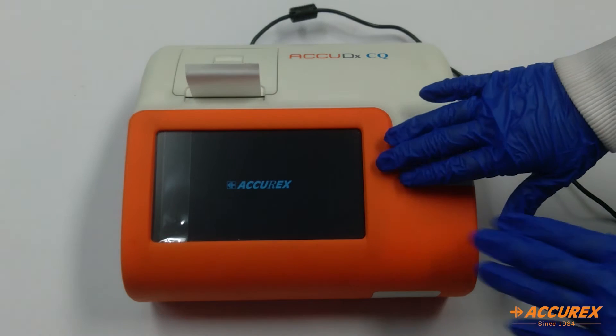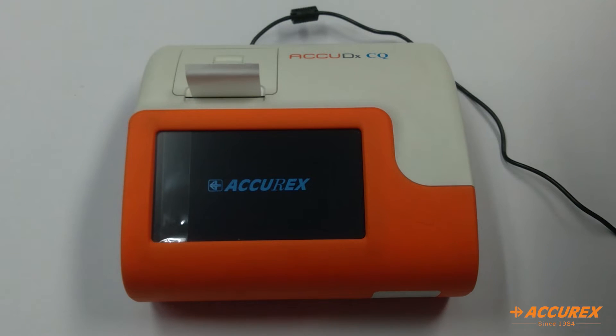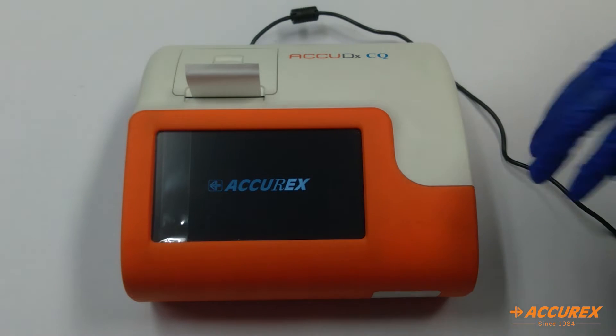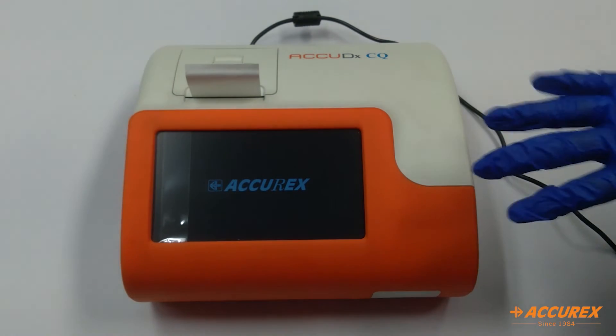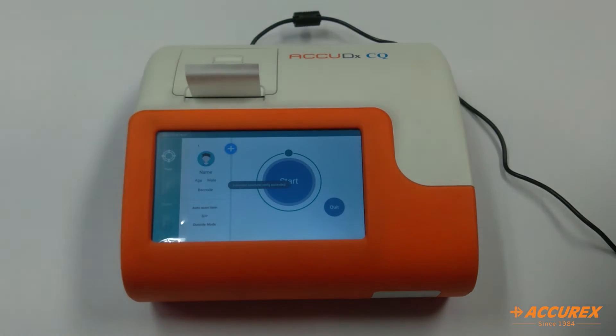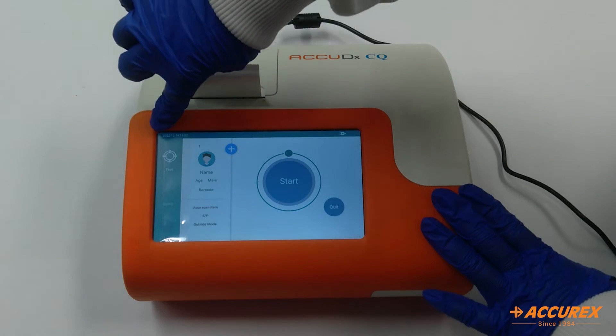This is the start screen. It will take two minutes to switch on. Right now it's initializing. The analyzer has started — here you can see the time and date.